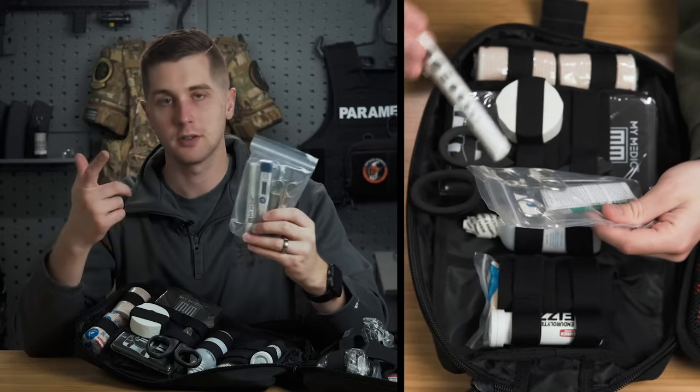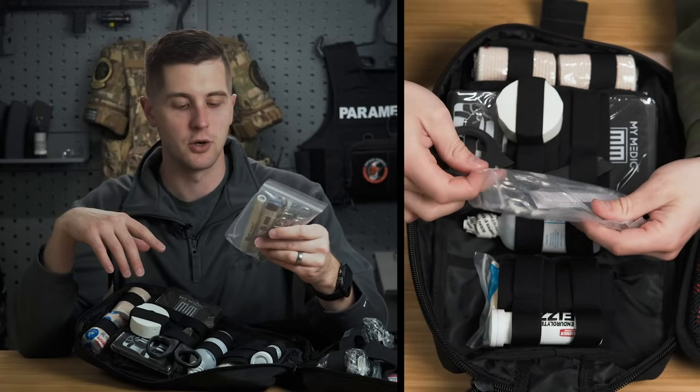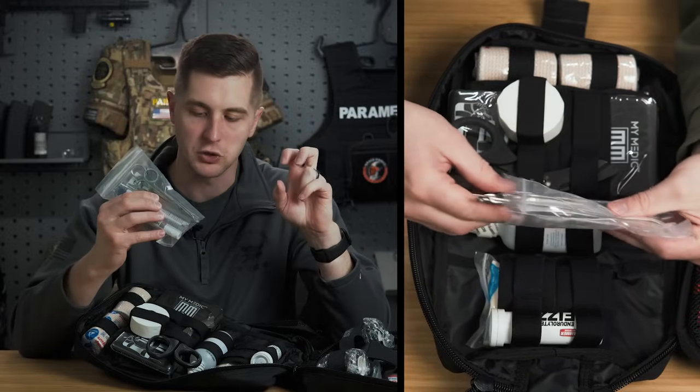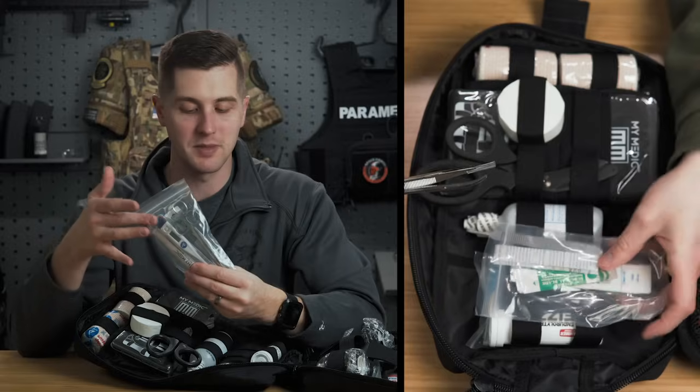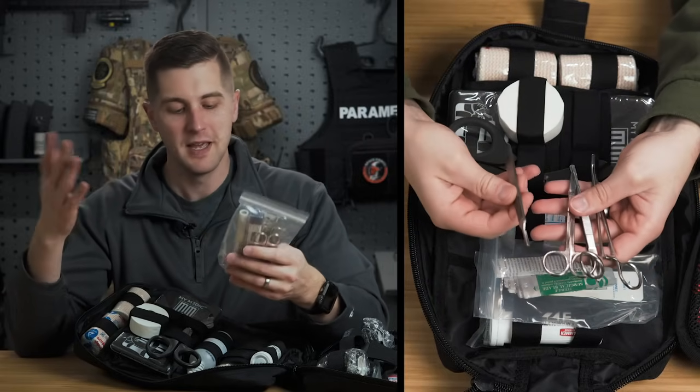Now, last but not least on this section, we've got kind of just miscellaneous tools. We've got a thermometer, great. Pen light to check pupillary responses. You can look into ears, noses, things like that. And then we have what I'd call a minor surgical kit. You've got a couple hemostats, you know, to pull out splinters, that kind of thing.